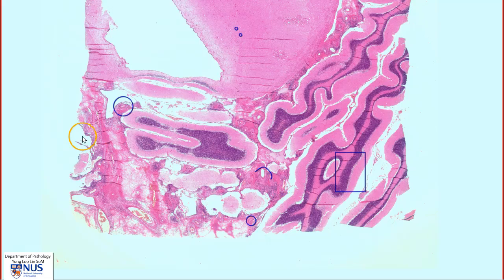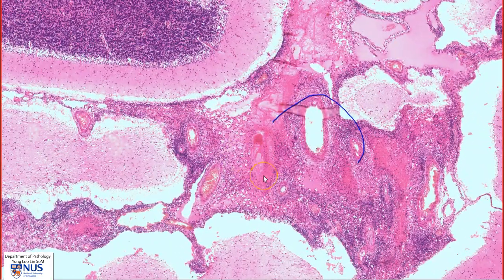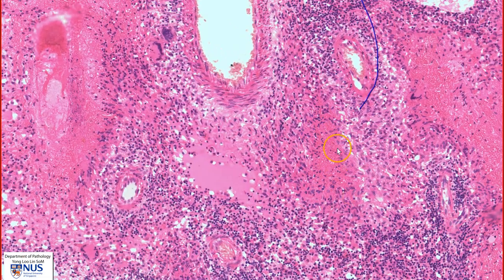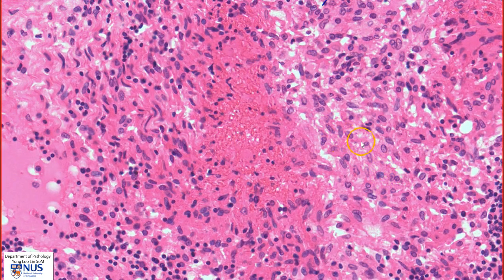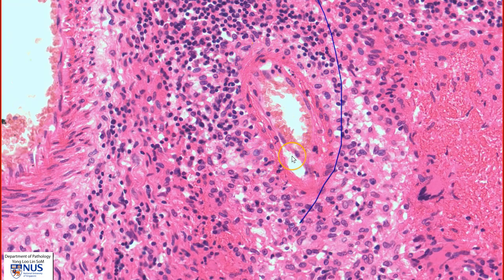In summary, this is a virtual microscopy slide showing the features of tuberculous meningitis, where the subarachnoid space is full of necrotizing granulomatous inflammation as well as chronic inflammation. Here we have a necrotizing granuloma, composed of epithelioid histiocytes with an area of central necrosis. Very often, the leptomeningeal blood vessels are also damaged, giving rise to thrombosis and potential infarction of the brain parenchyma. Thank you.